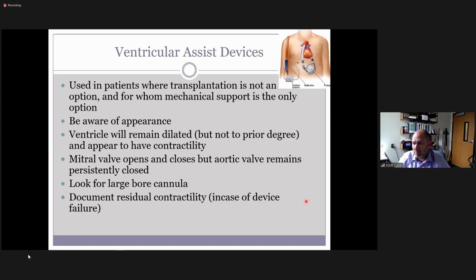Yep. I'm not that familiar with these devices because I didn't scan in a hospital setting. I scanned in a clinic. And again, these patients are kind of terminal patients anyway overall. I don't know how many of these come back from having an LVAD to a relatively normal lifestyle. Okay. And why do they do it? I don't know if they do it while waiting for an actual heart transplant. Typically it says here that you get this because you couldn't get a transplant. So maybe it's a temporary thing until there is a heart transplant. So that's obviously one way to correct it.